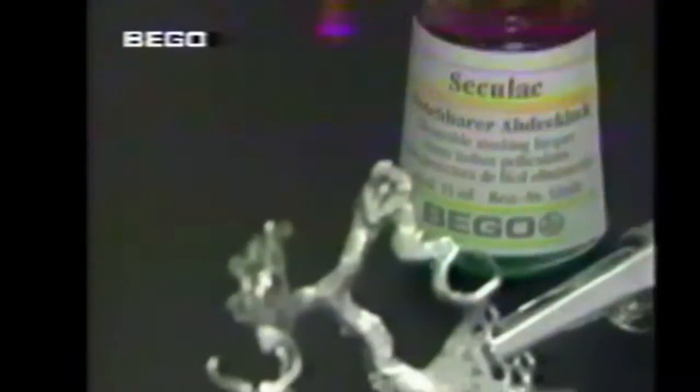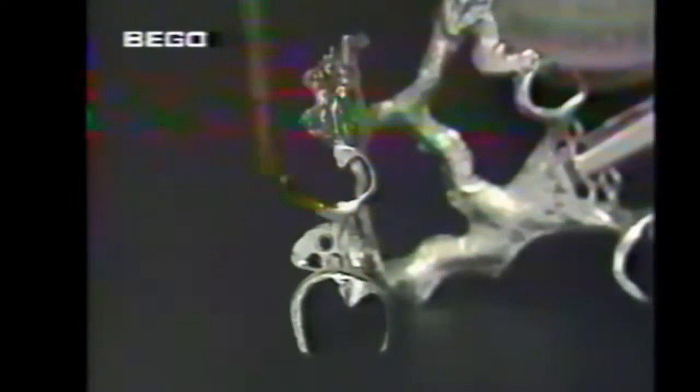It is advisable to work with a masking lacquer such as Seculac on critical areas such as stabilizers, female part holders, delicate clasps and rests. It's applied sparingly, dries rapidly, and is easily peeled off after polishing.